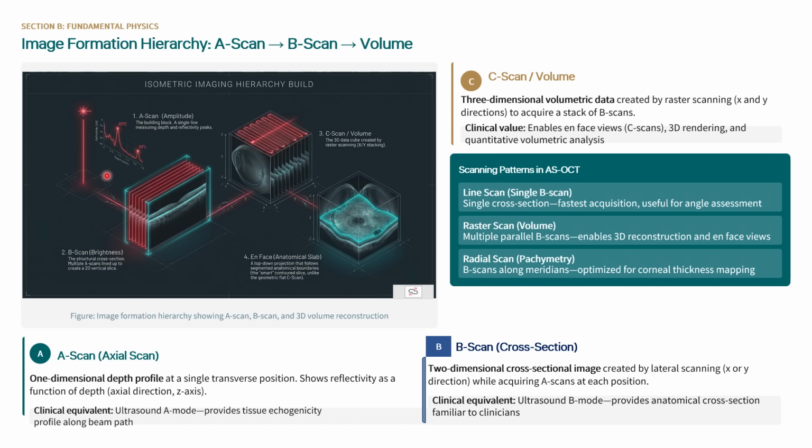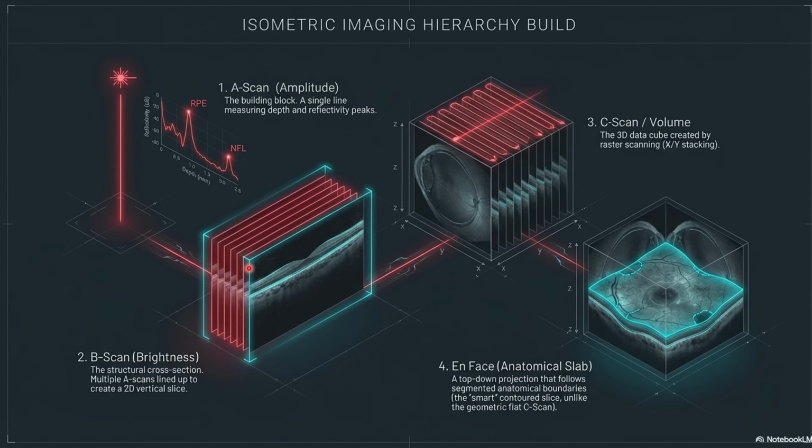Now, there is not much information, as you can see from the A scan. But if we collect these A scans in a vertical array along the XY axis, all these thousands of A scans will provide us the B scan. The B scan is brighter and a two-dimensional image. It is made up of thousands of A scans. I think if we take a bigger picture, for example, you can see here. So this is the B scan, made up of thousands of A scans.